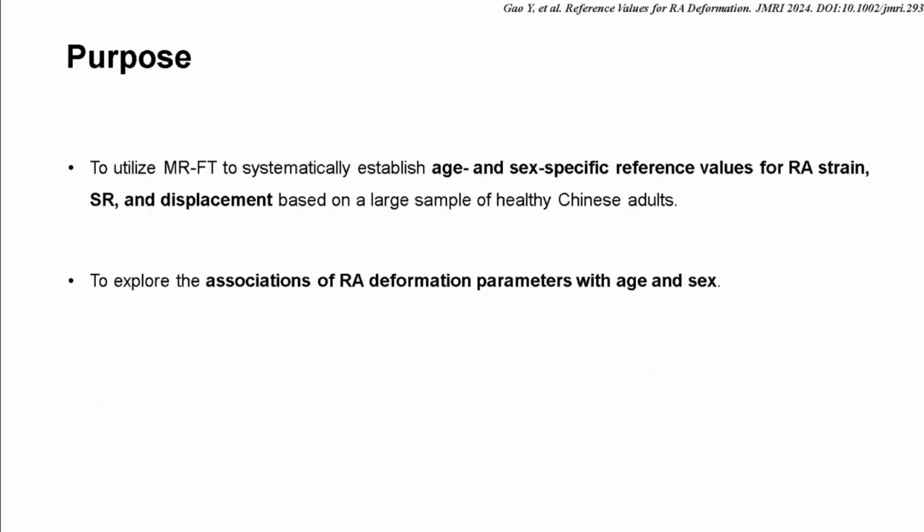So the aims of this study were to utilize MRFT to systematically establish age and sex-specific reference values for RA strain, SR, and displacement based on a large sample of healthy Chinese adults, and to explore their associations with age and sex.